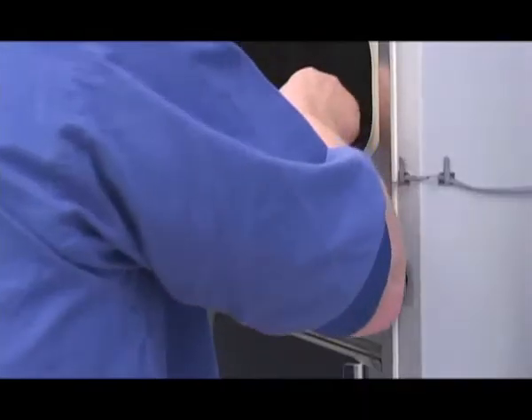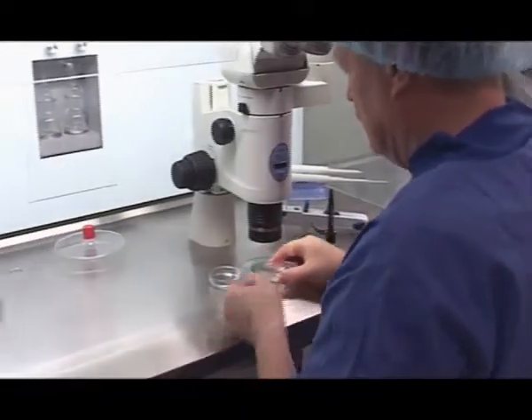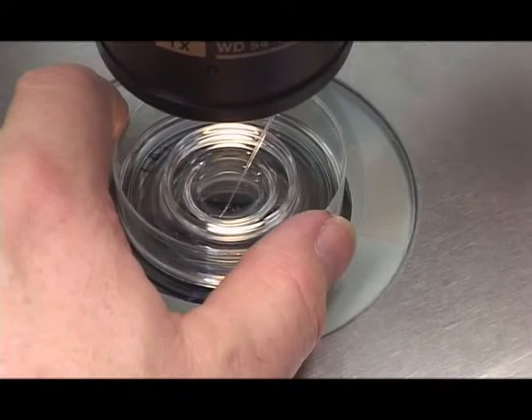Take out the dish with the patient's denuded oocytes from the incubator and place it under the stereo microscope. Wash the pipette several times with culture media.